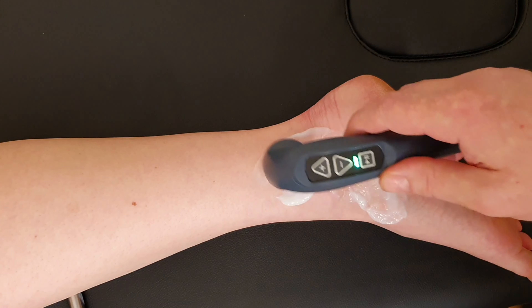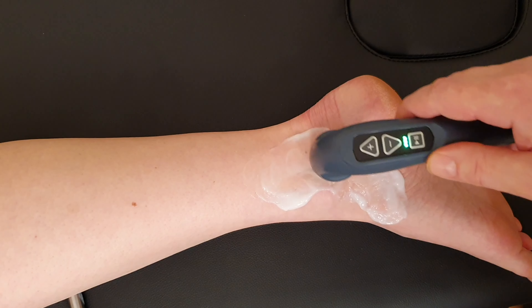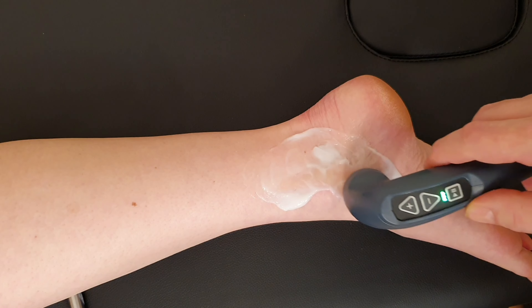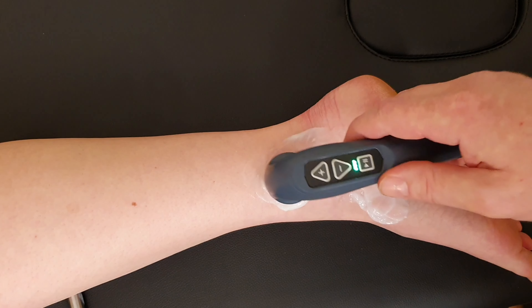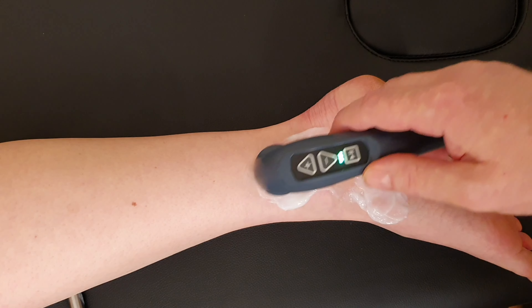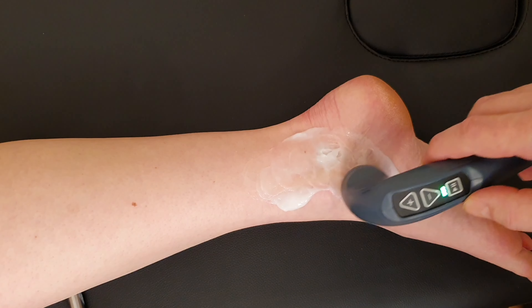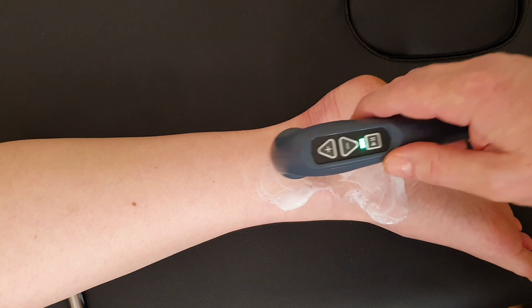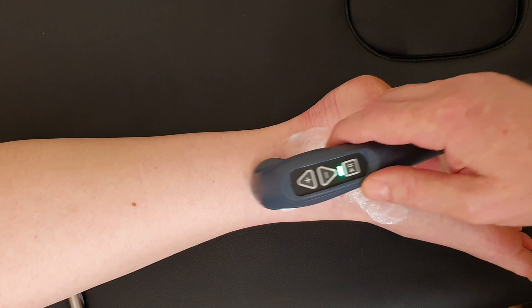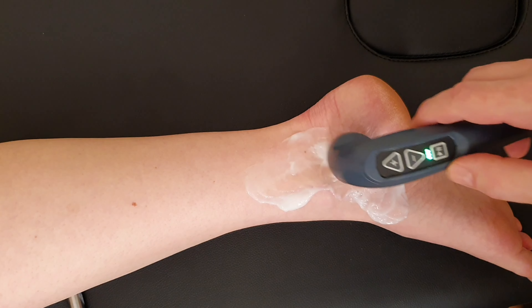I'm working my way around the tendon in fairly quick circles. I would expect this to absorb heat pretty rapidly. Starting off at level nine, you'll probably have to bring the machine down at some point during the treatment. It's very likely you'll get hot spots, so working around fairly rapidly — it is easy to just do the bit in the middle over and over again if you're not careful.